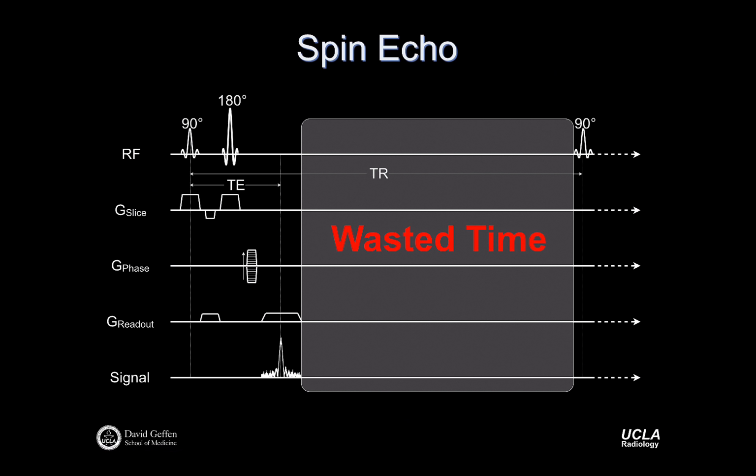Okay, so this is kind of switching gears a little bit. This is a very different sort of fast imaging technique. But what I like about this is it's kind of clever, and it shows some of the flexibility that's possible with MR. So let's think about this acquisition here. This is a spin echo acquisition, right? It starts with a 90-degree pulse that's slice selective, has a 180-degree pulse for refocusing, and then we more or less can quickly form an echo, right? Adjusting our TE for T2 contrast, adjusting our TR for T1 and proton density weighted contrast. That's all great. So we pick our TE and we pick our TR for contrast, right? That's what gives us the image quality that we want.